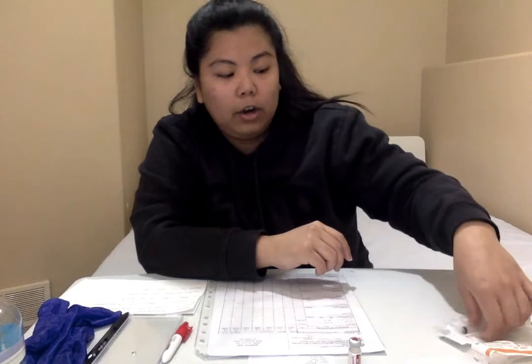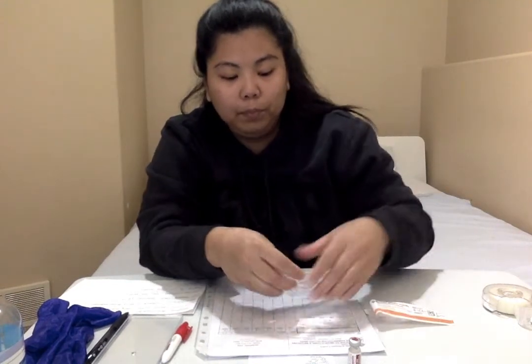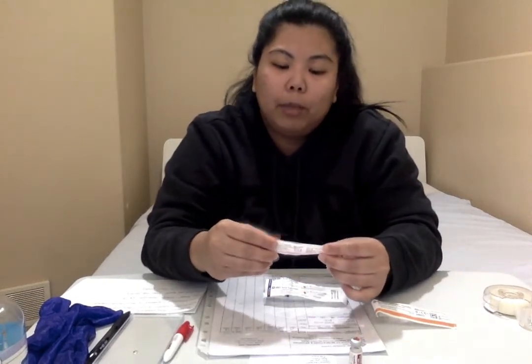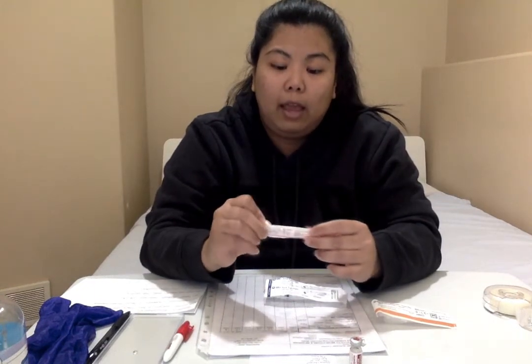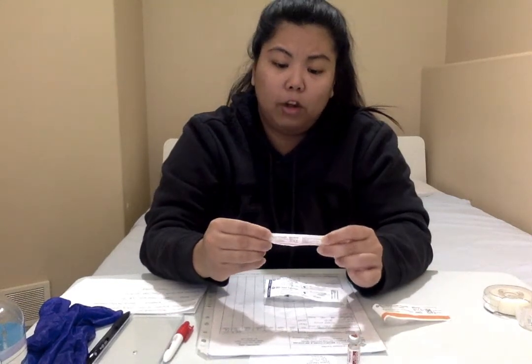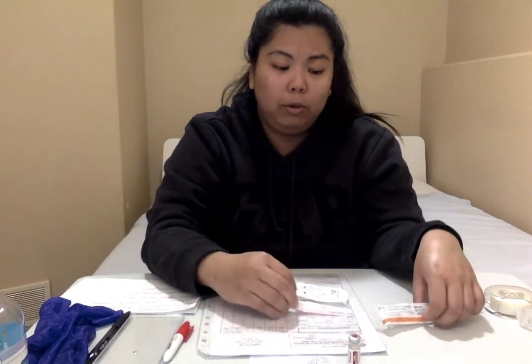And then we're going to get our needle ready and our syringe. So I have here a 3 ml syringe. And then for drawing up the medication, I have a blunt fill needle. This one doesn't have a filter since we are drawing up medication from a vial. We don't need a filter, but if we are drawing up medication from an ampule, then we would need a blunt fill needle with a filter.